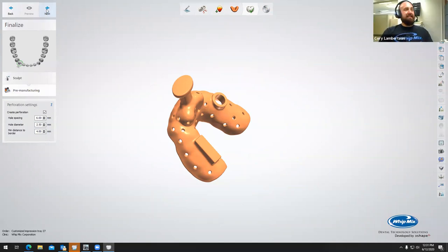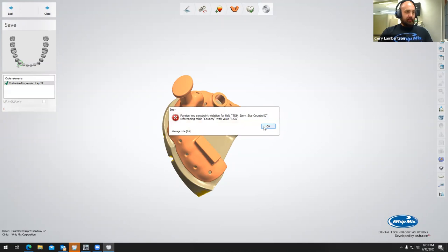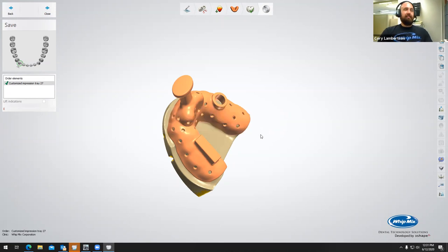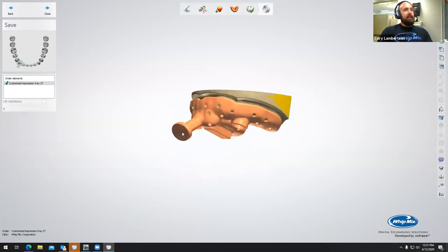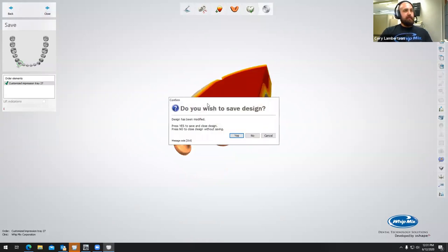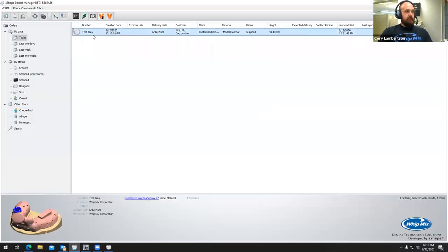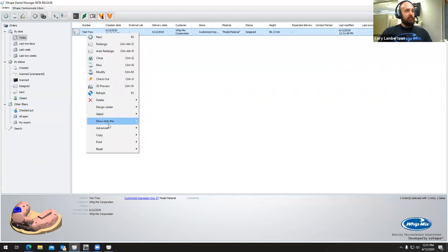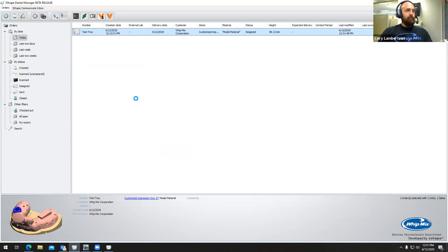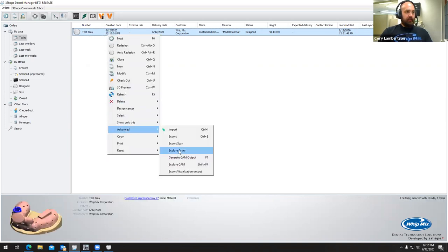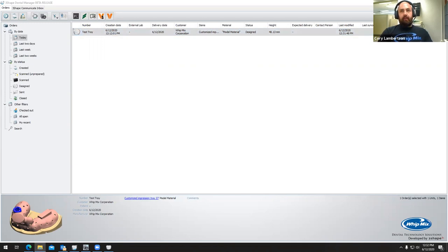We're going to go ahead and select next after we added our perforations. We're going to get an error that says 'foreign key constraint' — I'm not sure exactly what it is, but I think it's because this is the beta version of the software. We're going to select OK and then Close. Save the design — yes. Then we're going to right-click on the case, go to advanced, generate CAM output, right-click again, advanced, explore CAM. And now we have our customized impression tray.